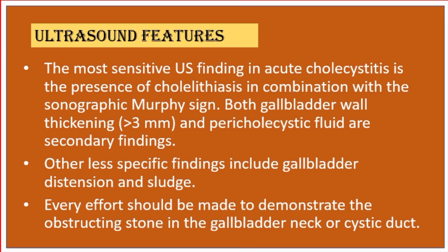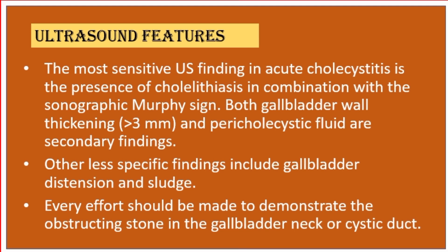Both gallbladder wall thickening of more than three millimeters and pericholecystic fluid are secondary findings. Other less specific findings include gallbladder distension and sludge. Every effort should be made to demonstrate the obstructing stone in the gallbladder neck or cystic duct.